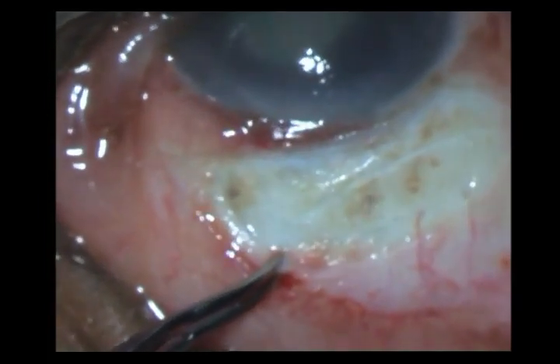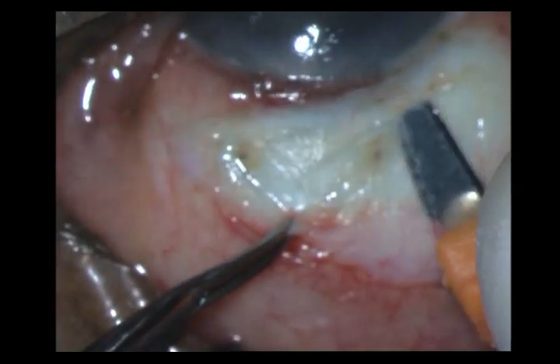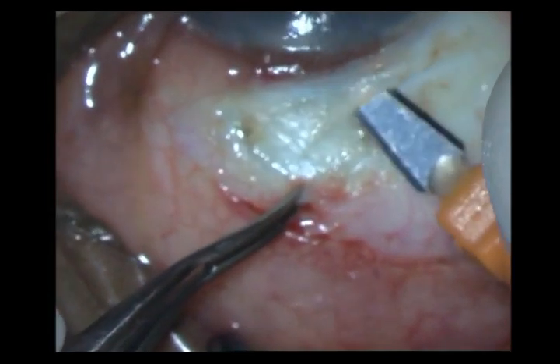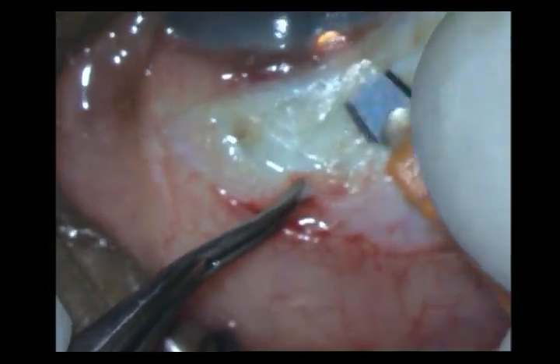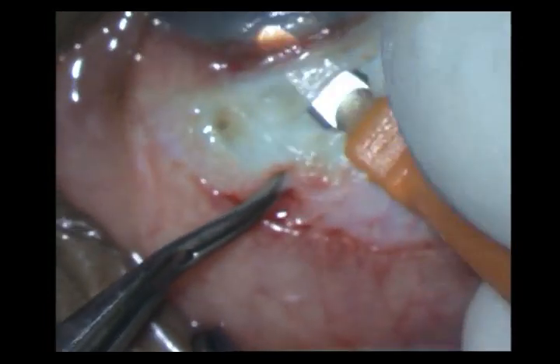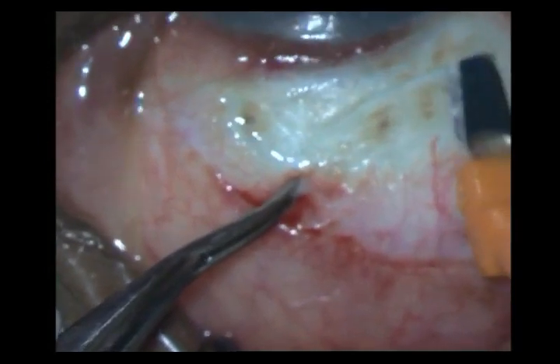Once done, I use my crescent blade to fashion the corneal-scleral tunnel. Just watch how I am going across the tunnel and making the incision. I am always trying to cut sideways and backwards, trying to avoid too much forward movement and prematurely entering into the anterior chamber.